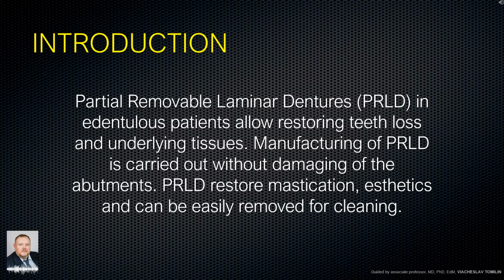Partial removable laminar dentures, PRLD, in edentulous patients allow restoring teeth loss and underlying tissues. Manufacturing of PRLD is carried out without damaging the abutments. PRLD restore mastication, aesthetics and can be easily removed for cleaning.